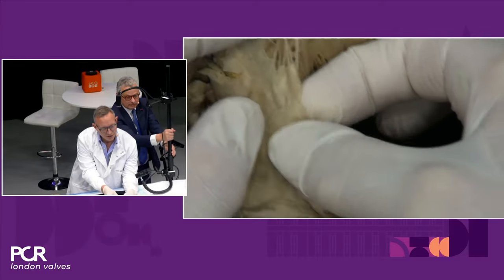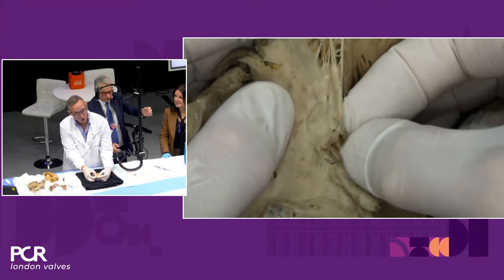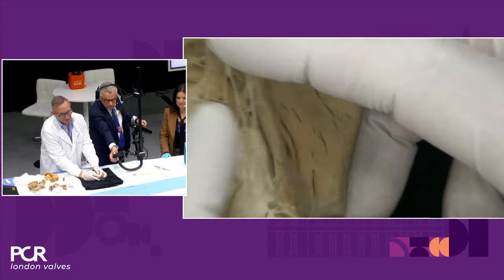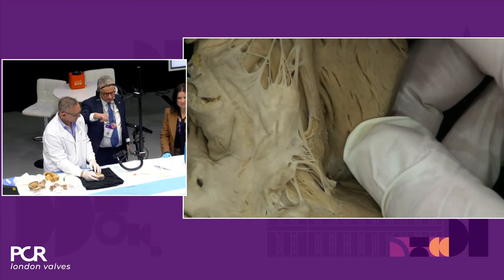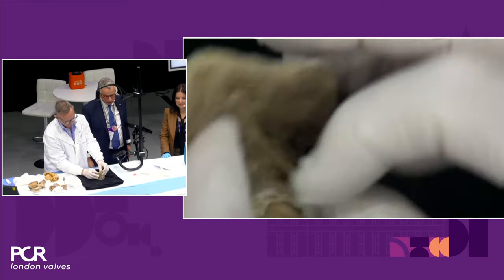If you look at the tissue, there's no obvious indentation or defects within the tissue, at least at the magnification we can see there. You can see the linear horizontal line there. There's really no impact.